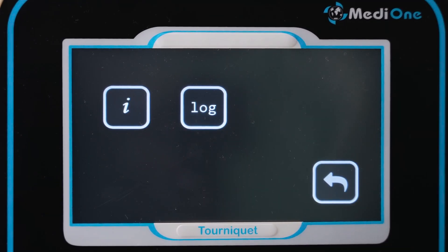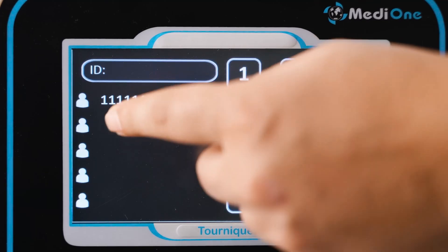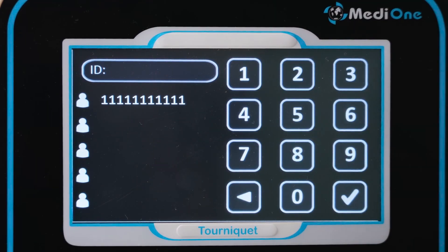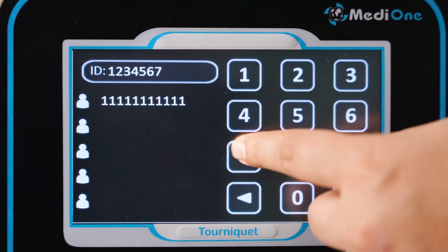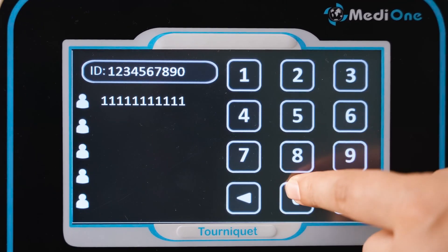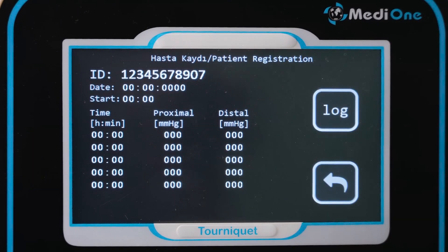When the sixth icon is clicked, two more icons appear. One of them is used for patient registration — by entering an 11-digit ID number, the patient can be registered and the last five patient records can be examined. The last five values applied to the patient are displayed with date and time.